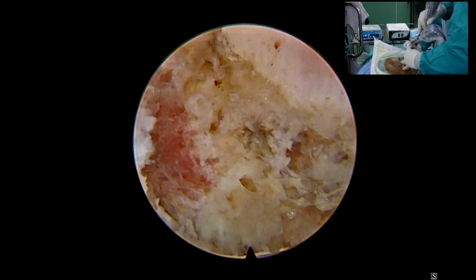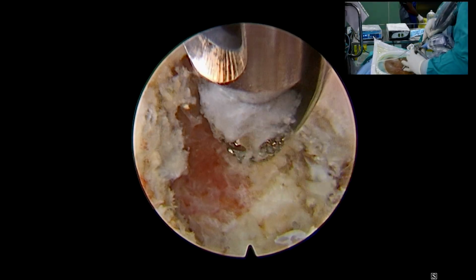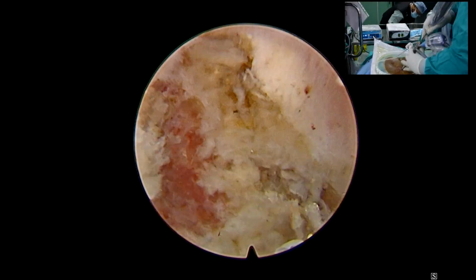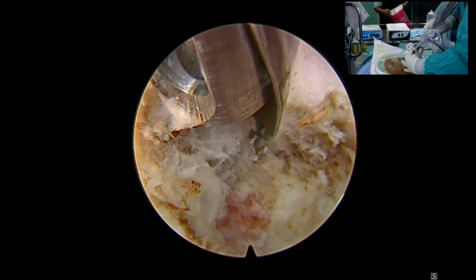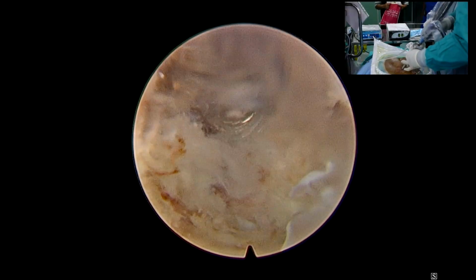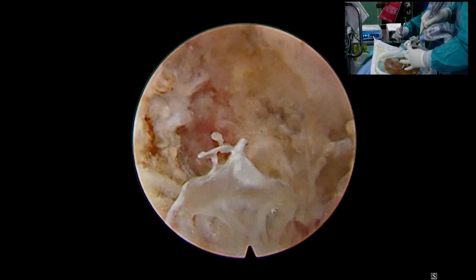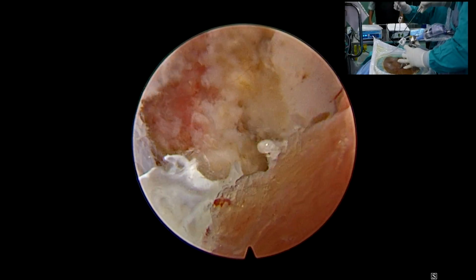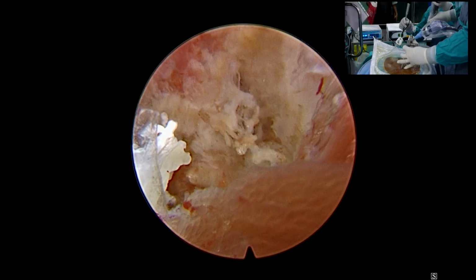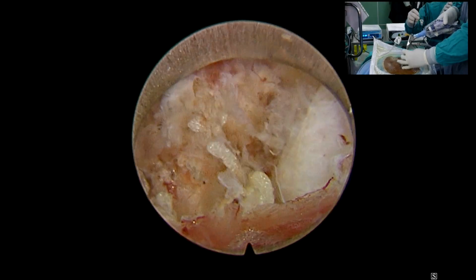Under this will be the spinal cord, you're going from posterior. Look at him. Towards Dr. Shubhendu's side will be the facet. Above will be one lamina.